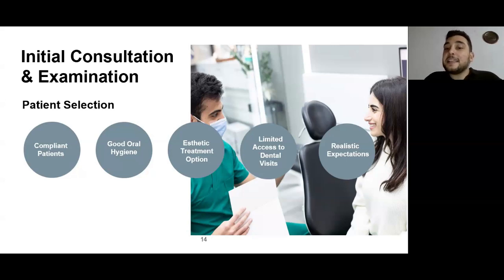Also for patients who have limited access to dental visits, so patients who are working a lot, who are always on the go, who need to travel a lot, clear aligners require a smaller number of visits compared to fixed braces. This is a treatment modality where you manufacture the aligners from the beginning of the treatment. You give a number of aligner trays to the patient, and they change them every week. A lot of the time, you don't need a lot of follow-up appointments unless you're going to change an elastic, or you just want to follow up and check that everything is going all right. So for patients with limited access to dental visits, this is going to be a perfect treatment modality.